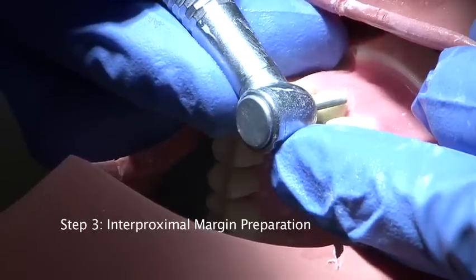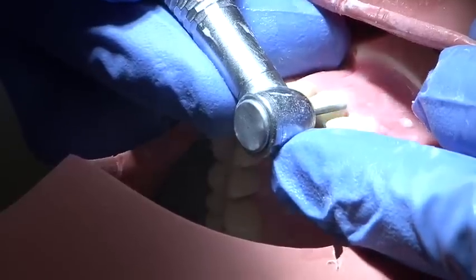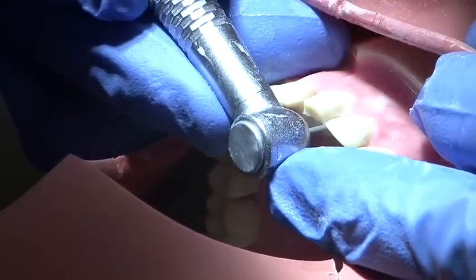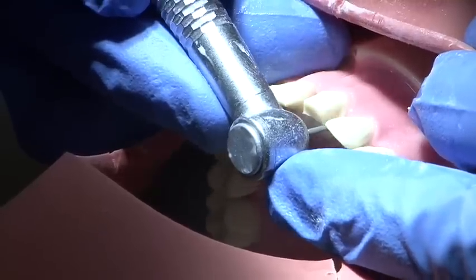Interproximal margin preparation is carried out using a medium grit parallel sided round ended burr. The margin is prepared to a depth of 1-1.5mm and a deep chamfer or rounded shoulder preparation is employed.